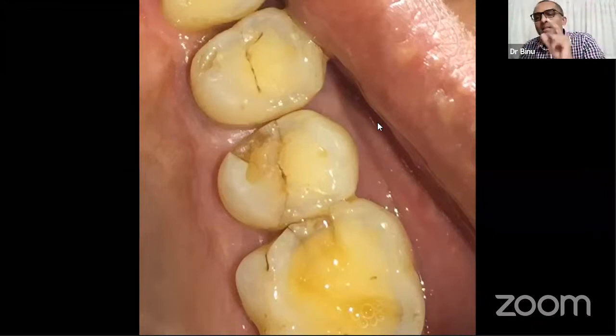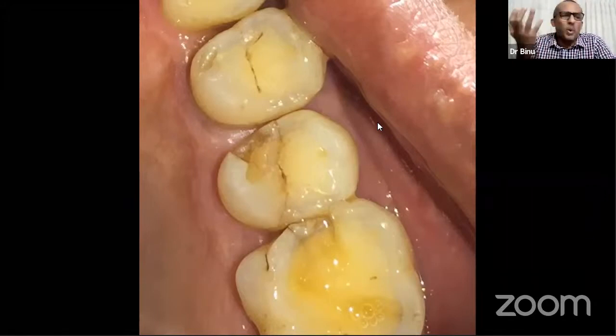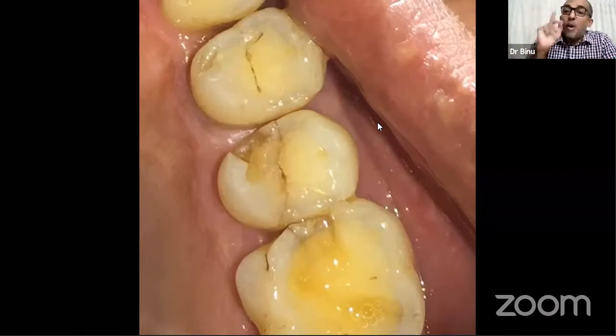To make them understand the seriousness of the scenario, you need photos. And for these kind of close-up pictures, let me tell you, somebody asked the question already. Intraoral camera is the best. So you don't have to invest in that digital SLR. You can invest in an intraoral camera, which is like 3,000, 4,000, 5,000 rupees. You get beautiful intraoral cameras. Let me tell you, an intraoral camera should be part of your dental chair, like the aerator there, next in the slot should be an intraoral camera in your clinic.